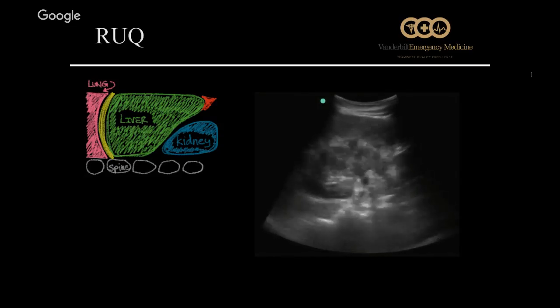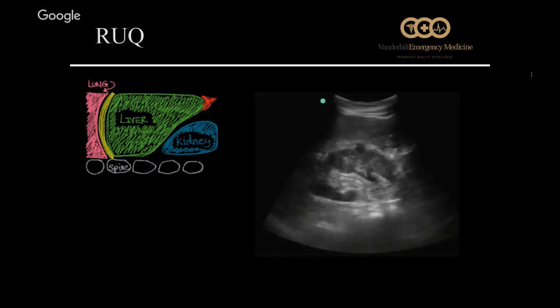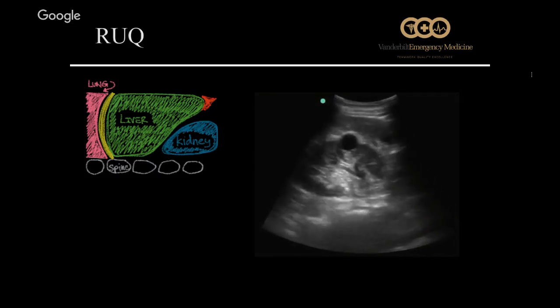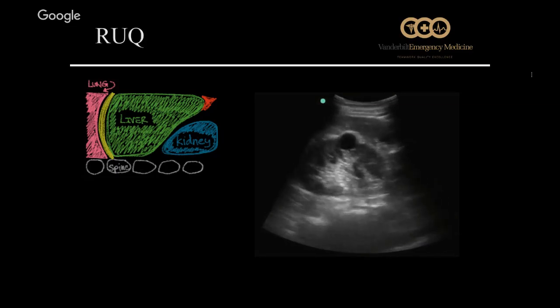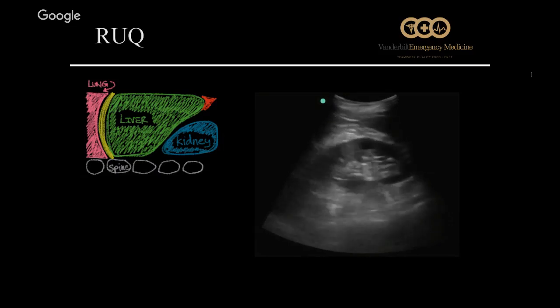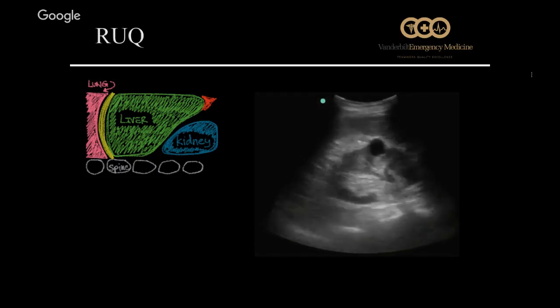So this one's a lot more subtle. You see highlighted in the middle of this image is a great view of the kidney, and we see that cyst on the edge of the kidney has nice round soft edges. But if you look very closely, and it's not present throughout the whole clip, on the right side of the screen we see just a tiny bit of free fluid at the tip of the liver with those pointy black sharp edges. So this is a pretty subtle finding, but a good comparison of fluid where it's supposed to be inside that cyst, and then fluid in the peritoneal cavity where it shouldn't be. Next slide.